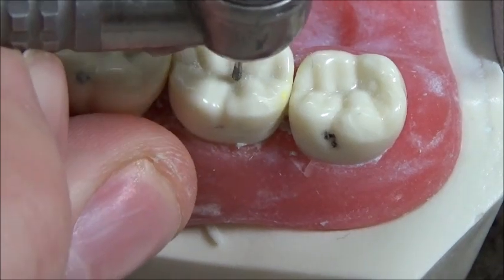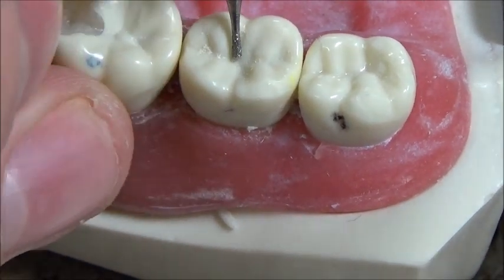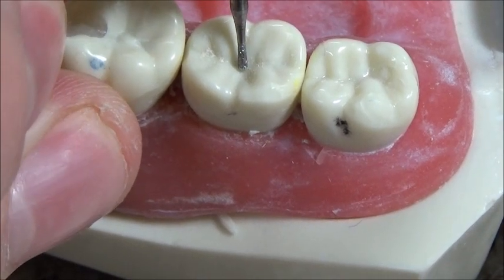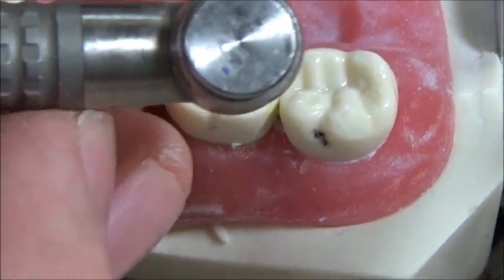So I'll go ahead and start the prep. What I like to do first is begin in the middle, do a punch cut down to about where I think 1.5 is, open it up laterally, and then measure. I'll go ahead and demonstrate that right now.